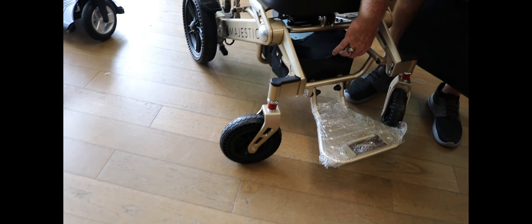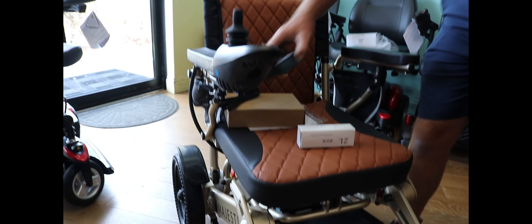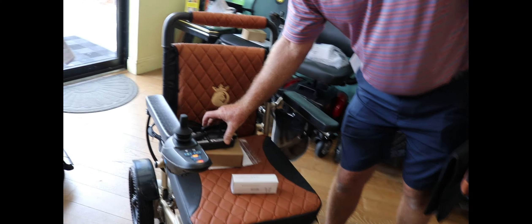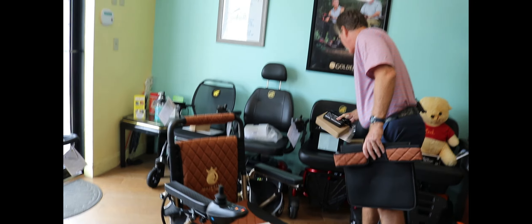You've got under-seat storage, which comes in very handy. It also comes with an off-board charger — easy to use. All you do is plug it into the wall.